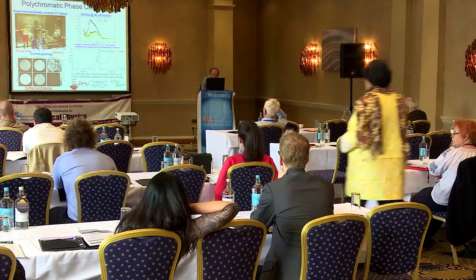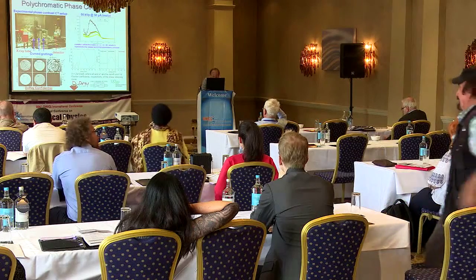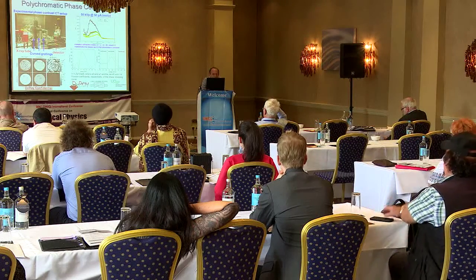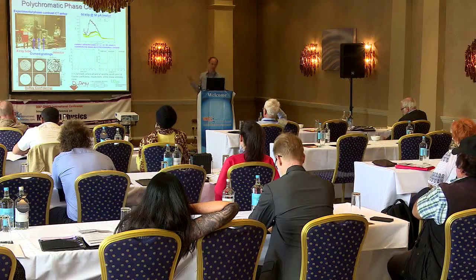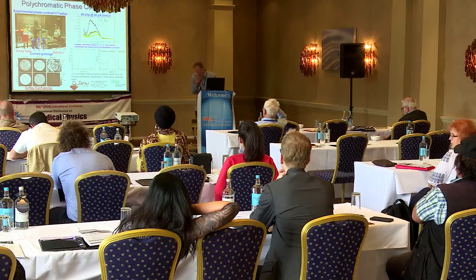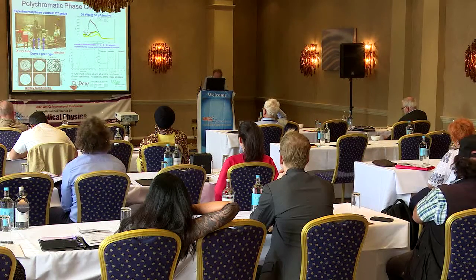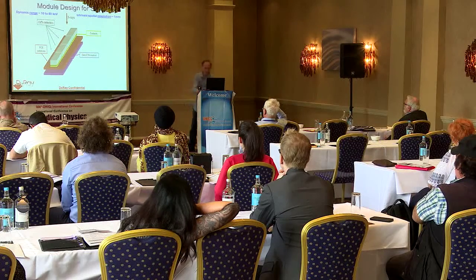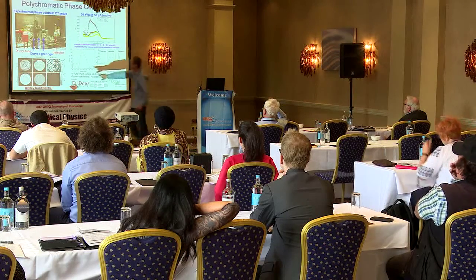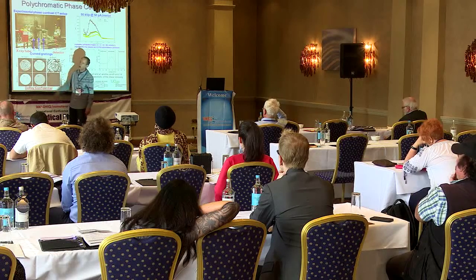So here in some phantom images, you can see a phantom, and this contains water and water plastic. And so water and water plastic cannot be resolved using attenuation-based measurements, because the Hounsfield unit is the same for the water and for the plastic. And so down here you can see in the absorption images, you cannot distinguish between the water and the water plastic.